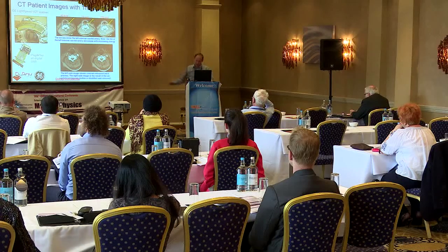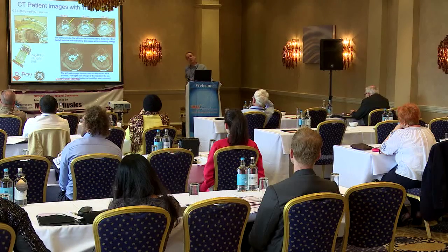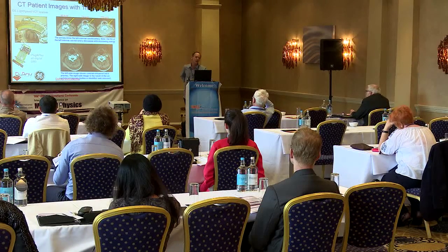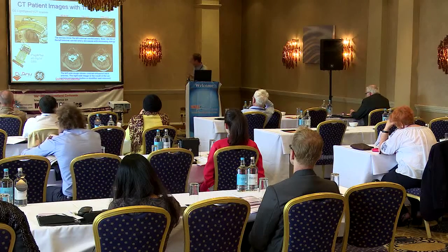And here I present the first patient images using a spectral photon counting system, and we can see the advantage of using the photon counting system.